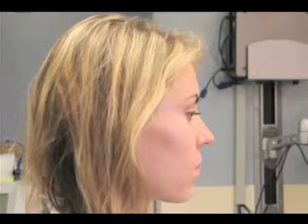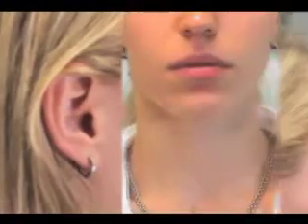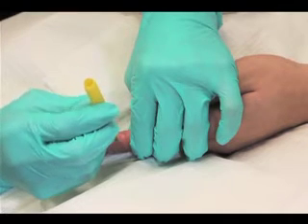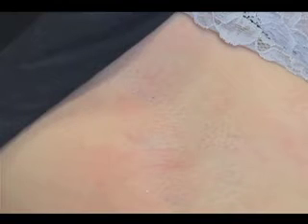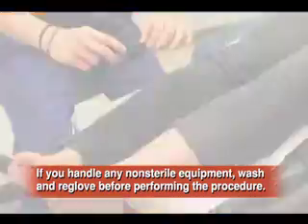If you have a choice, avoid doing a punch biopsy on the lower extremities. Biopsies performed on the back can have poor aesthetic results because the scars may stretch. Avoid doing punch biopsies on the face whenever possible. If obtaining a specimen from the face is unavoidable, remember that scars behind the ears, under the jaw, and at the hairline are the least visible. Plunging a biopsy punch into the temple, a finger, or the jaw may result in substantial injury to a nerve or artery. It is also possible to lose a biopsy site once it heals, as the lesion may no longer be visible, which may be problematic if further treatment is indicated. Taking a photograph of the marked biopsy site with the patient's consent is recommended.